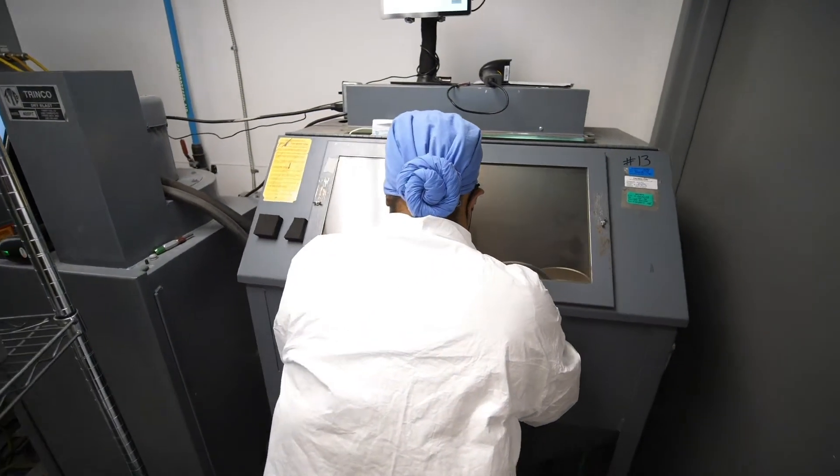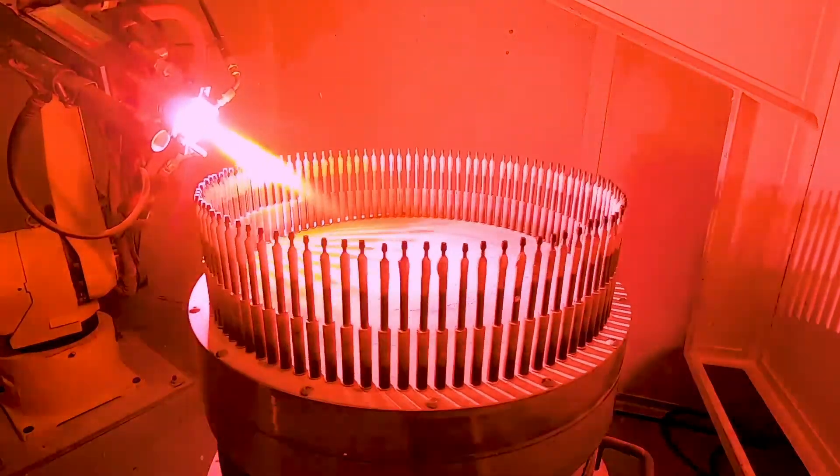Any implant that we need to be held within the vacuum chamber, we make our own fixtures at our own shop. So if we get a new implant in and we don't know how to hold it, we have our engineers design up a fixture, take that to our shop, draw it up with the designer, and then they machine it out.